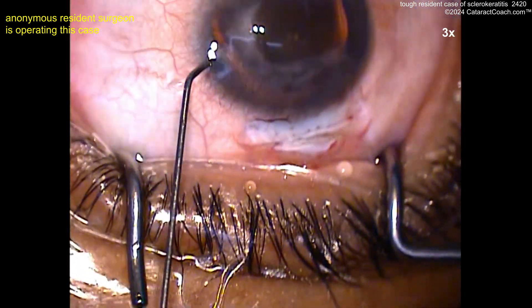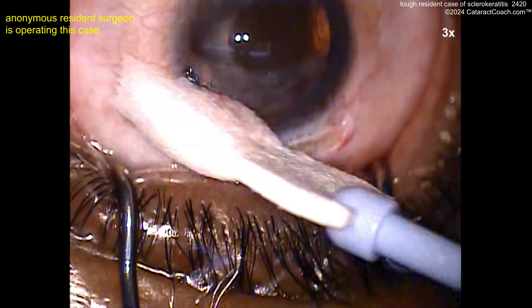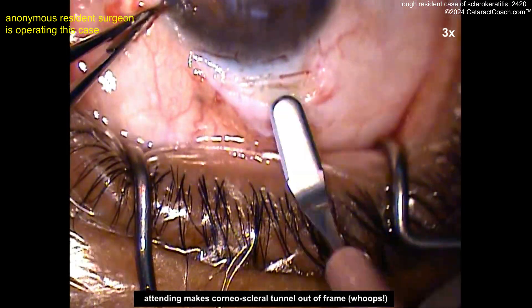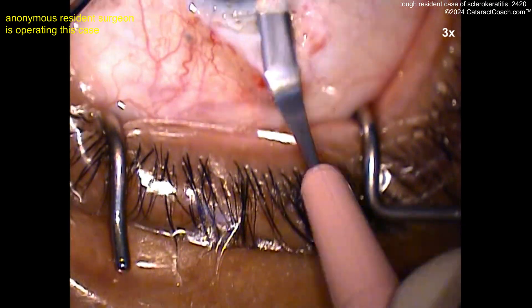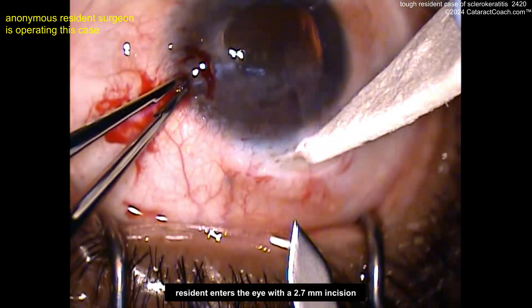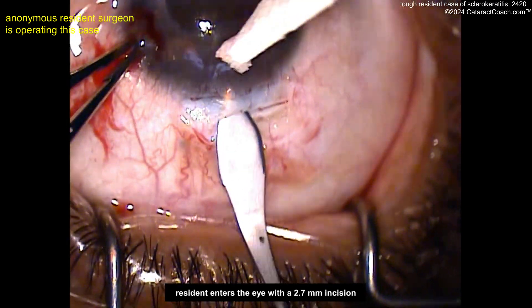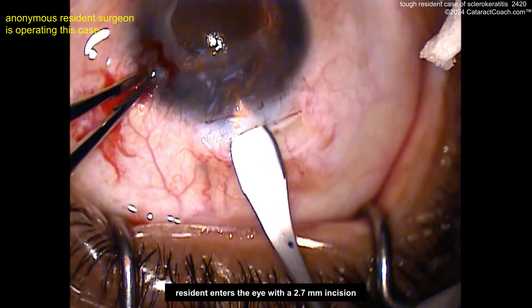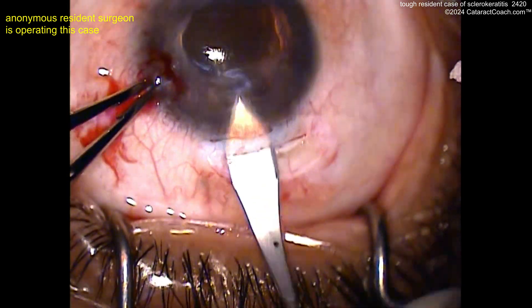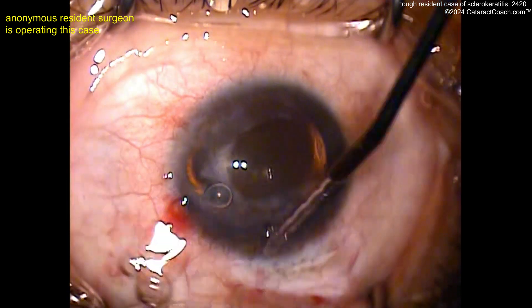So maybe the patient's on a blood thinner. Trypan blue dye, staining the anterior lens capsule. Now let's see the scleral tunnel continuing — this is the attending making that scleral tunnel. Now the resident going in with the keratome. You've got to wiggle the technique — it's better because you don't want to create a different path. But that looks good, a good incision there. Now more viscoelastic.